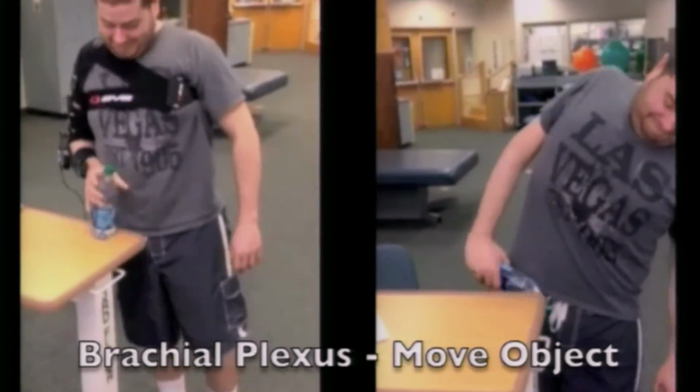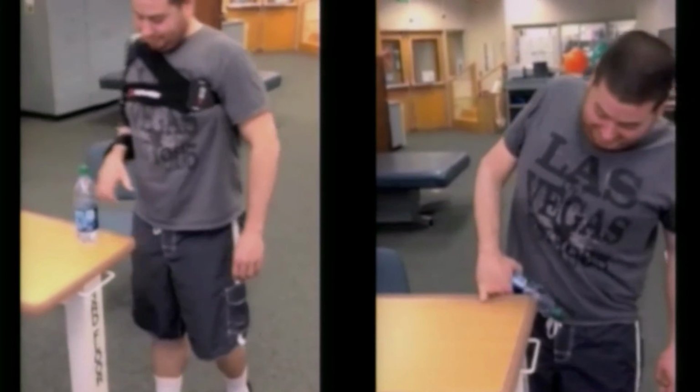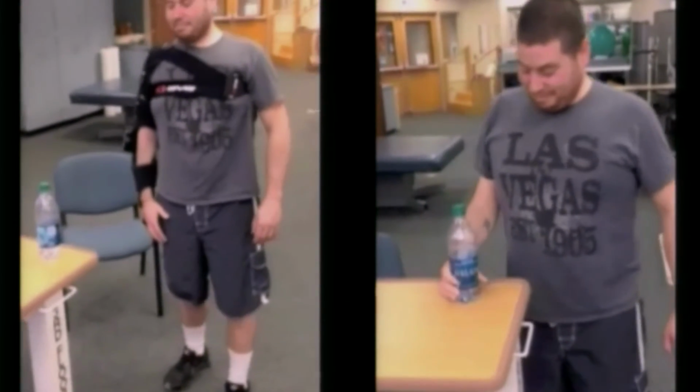This gentleman has a brachial plexus injury. This is actually just a little bit of a demo unit that happened to fit him. We usually don't recommend hooking up too many patients to units that don't fit them, but it happened to fit him, so he was able to show us moving some things around. And he had on that harness as well, like we were talking about. Since we have just a few minutes here, let me hook this up. What other questions did you guys have?